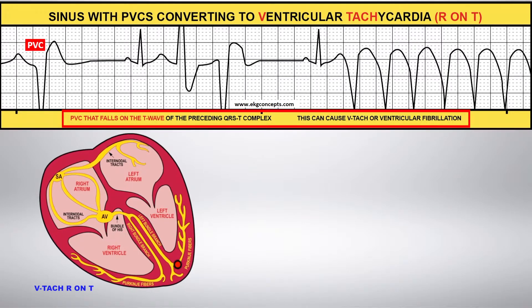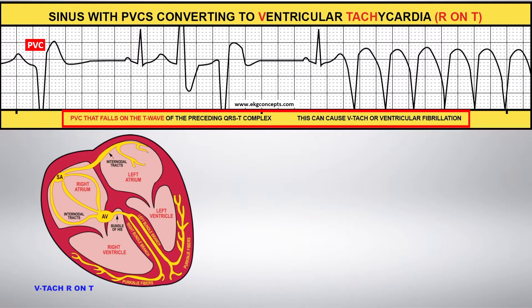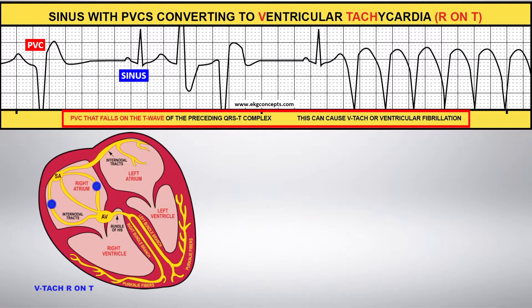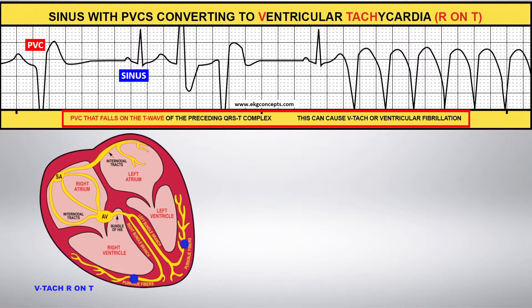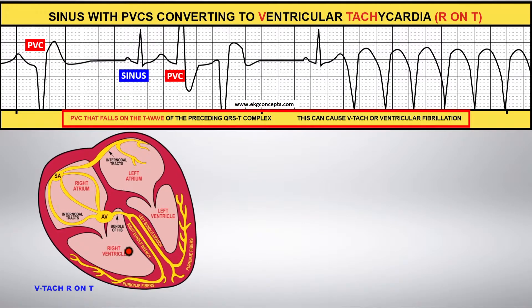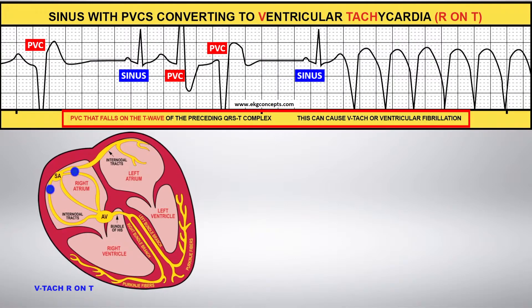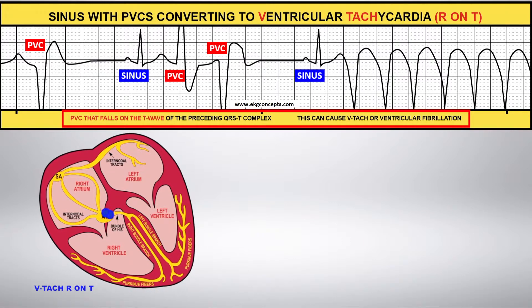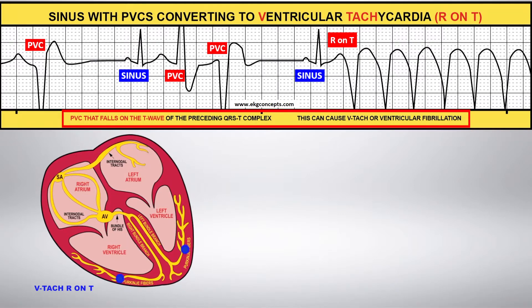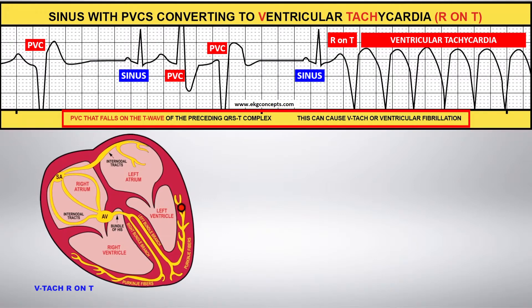This example shows a PVC, followed by a sinus, followed by another PVC, and another PVC, followed by a sinus, then the R on T moving into ventricular tachycardia.